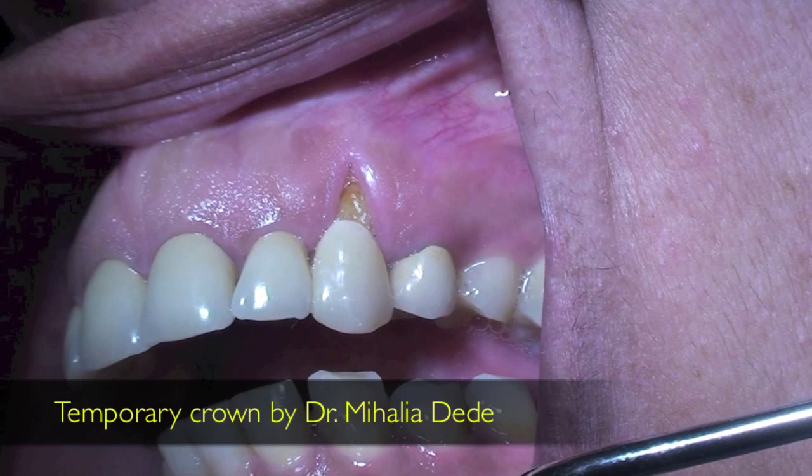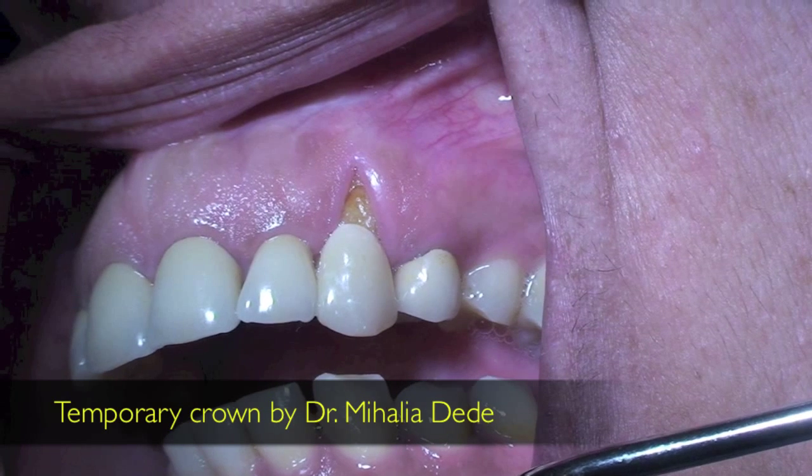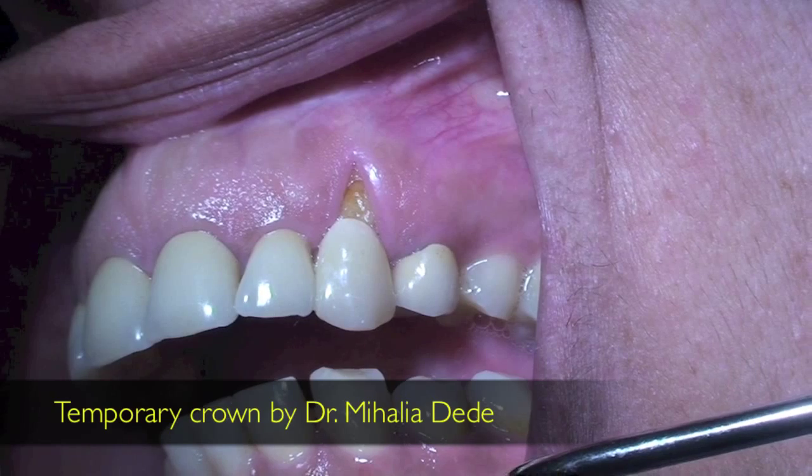We requested first from the general dentist to place a temporary crown on the tooth, establishing the margin at the level that is desired for the final outcome. So at this level, we're ready to proceed.